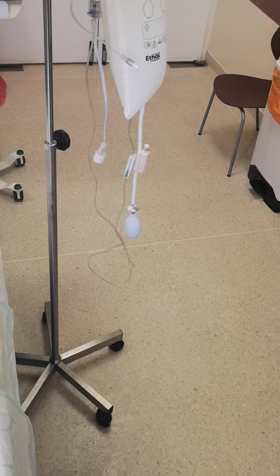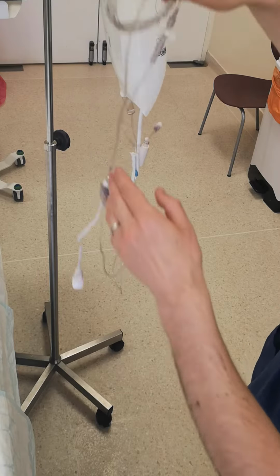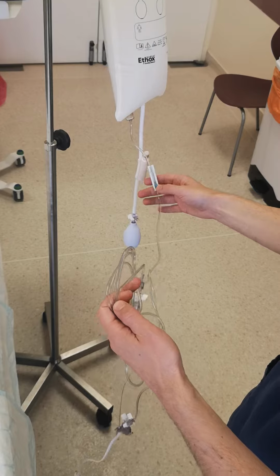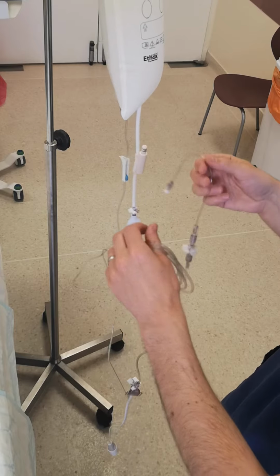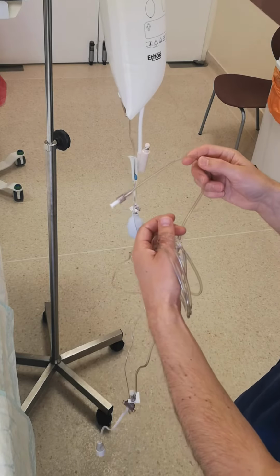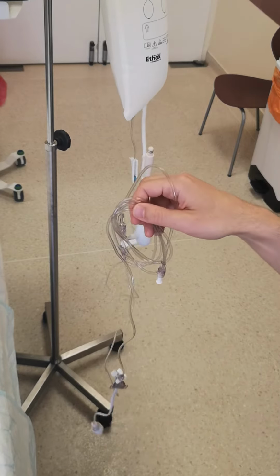Okay, so having set up the tubing, like I said before, you can close this valve just whilst it's waiting. And then what we're going to need to do is connect it to the placed arterial cannula and zero the line. You can actually zero the line before attaching, but most people tend to attach first and then zero.